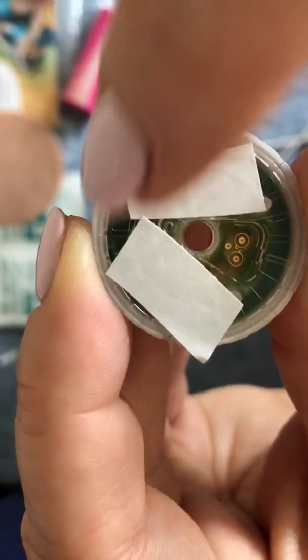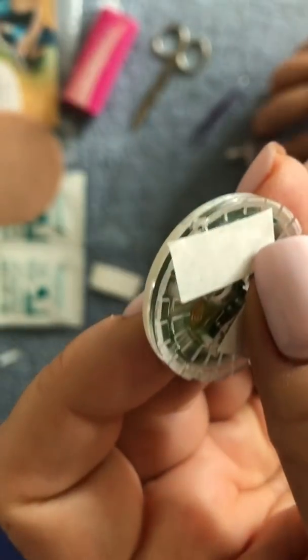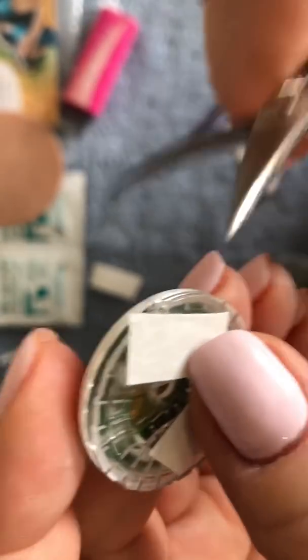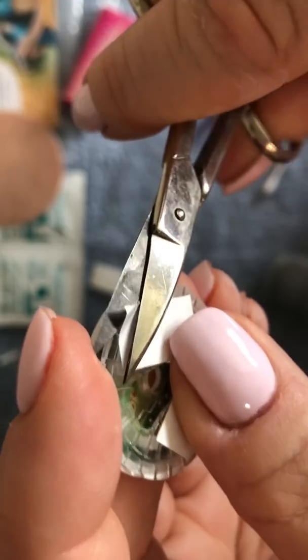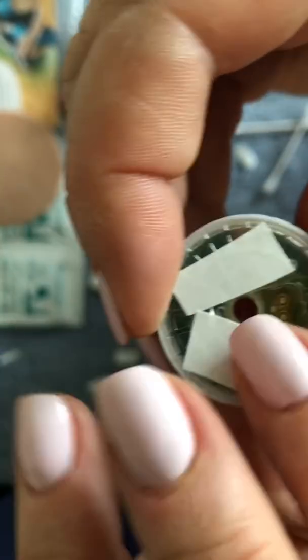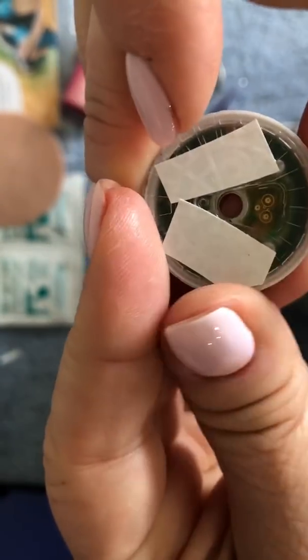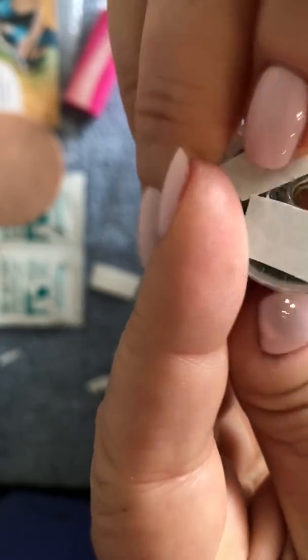Now, if you notice you have some of it maybe hanging off, it's important that you trim that off. And the reason why is if you put it hanging on there, it may stick to the launching sensor, or the launching unit, and you don't want to do that. So right now, we're pretty much done with the fashion tape, or you know, the double-sided tape, okay?